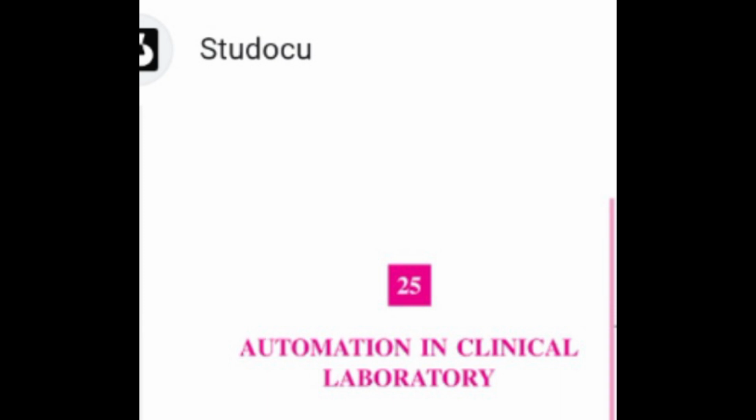Terms used include: batch analysis, continuous flow analyzer, discrete analyzer, multi-channel analyzer, single channel analyzer, centrifugal analyzer, large instrument, small instrument. Non-discretionary: all tests are performed on each sample. Discretionary: tests are selected for each sample.